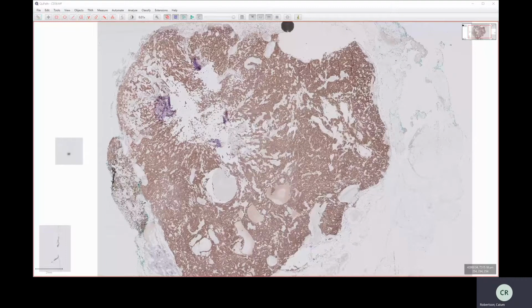Immunohistochemistry, or IHC, is the main adjunct test that we use in tissues in diagnosis based on tissue sections. You can also use immunocytochemistry, or ICC, based on cytology preparations. But I've not got examples of them here, but it's exactly the same principle. I'm going to talk about IHC in this video. So immunohistochemistry is the main adjunct test that we use to supplement H&E sections for H&E diagnosis.